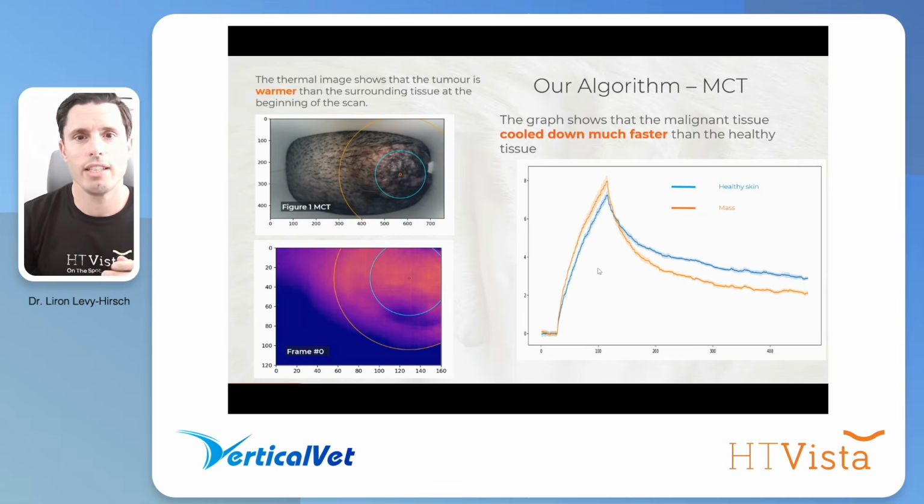And you can see here, this is obviously just a demonstration, because it's much more complicated than that, but you can see the process, how the tissue gets heated and then cools down. And what you can see on the top left corner is a mast cell tumor that you can see in the optic camera. And quite interestingly, what we are showing you on the bottom left corner is the thermal properties of the tissue before it gets heated.